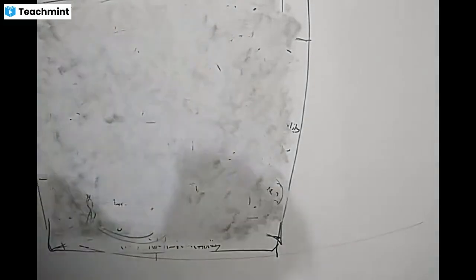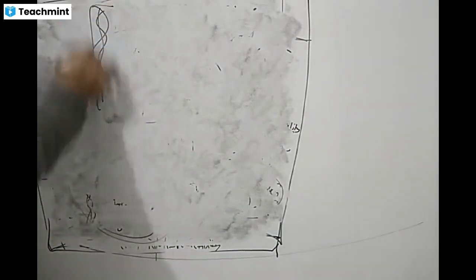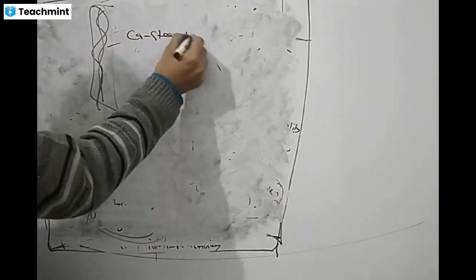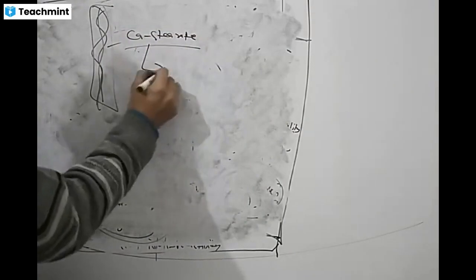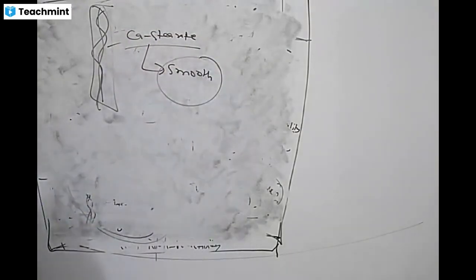Because Vicryl is multifilament, there may be more capillary action and more tissue drag, but in case of Vicryl, this multifilament is coated by calcium stearate that makes its surface smooth.